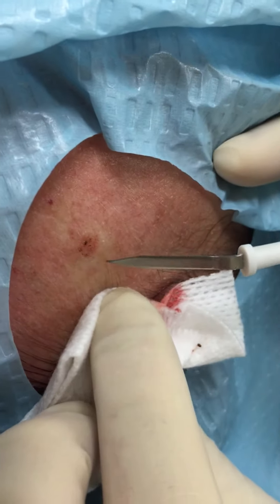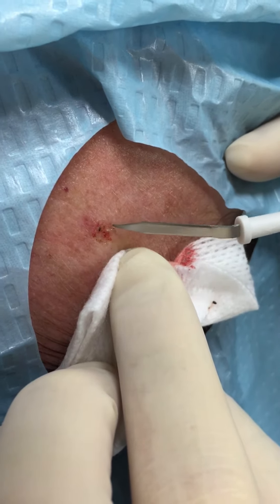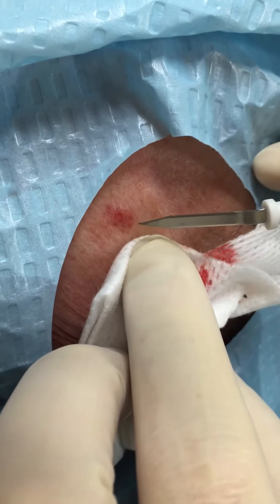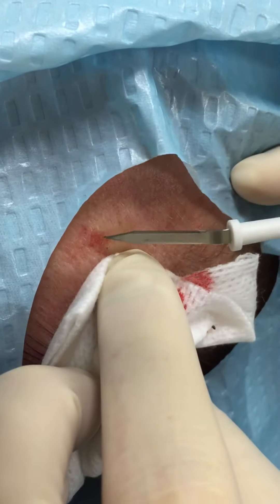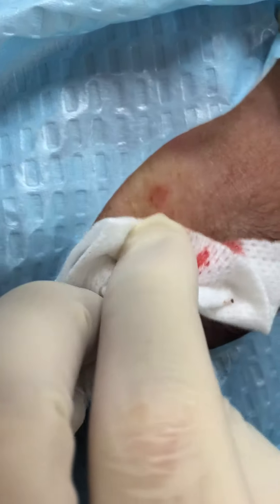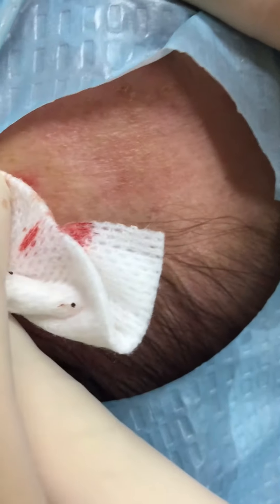So I slowly run the diathermy tip over it, the bleeding will stop — it's using very low energy. And then that's it, it's all done. And then we just put some solocyte gel in. Too easy.